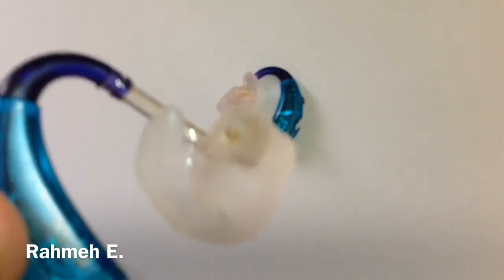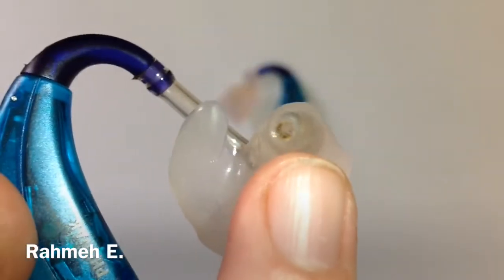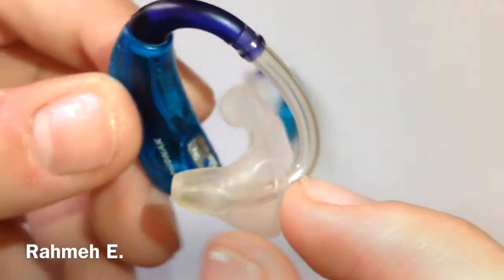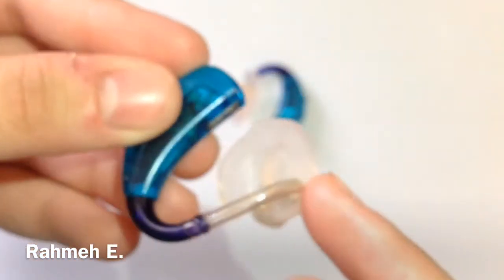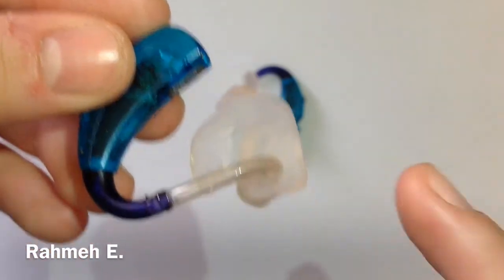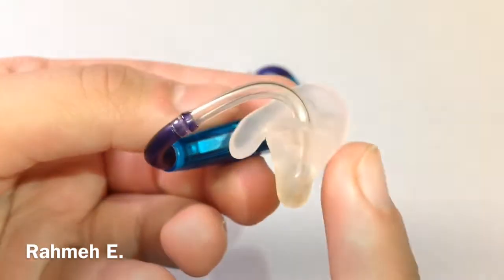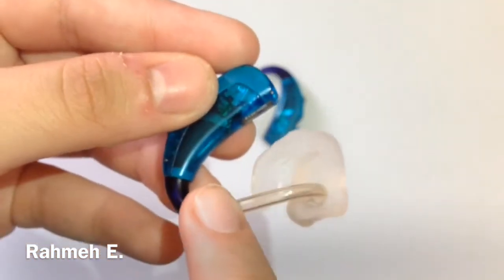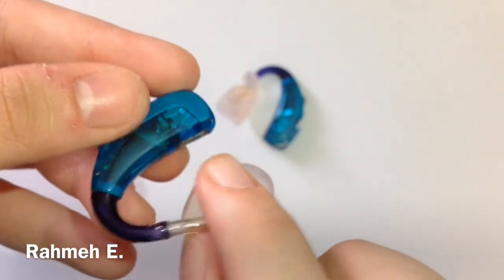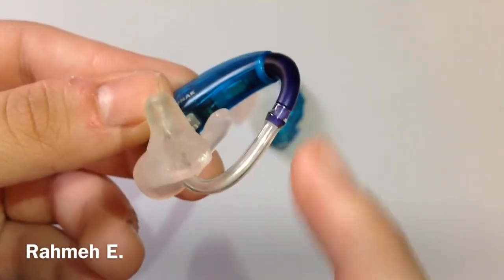I don't know if you guys can see, but there's a little hole in the ear mold right over here. In that hole is a tube, and when you turn this hearing aid around you'll see the tube coming out. That tube goes from the hole in the front all the way through the ear mold into the hearing aid. I'm pretty sure this is where the sound goes through.